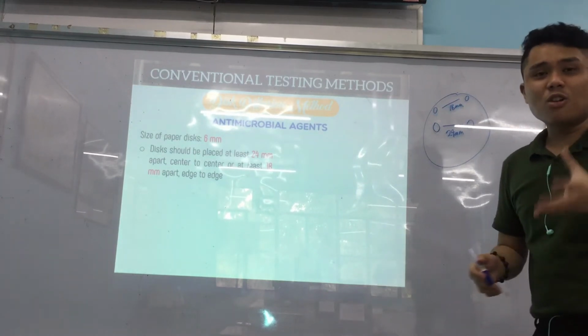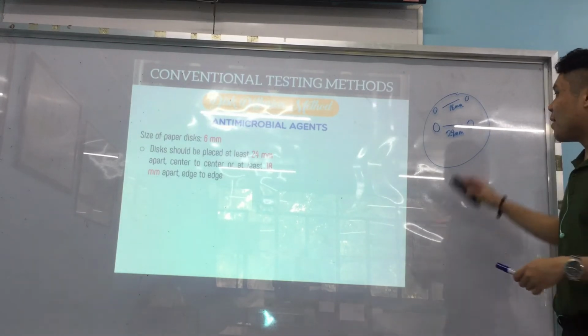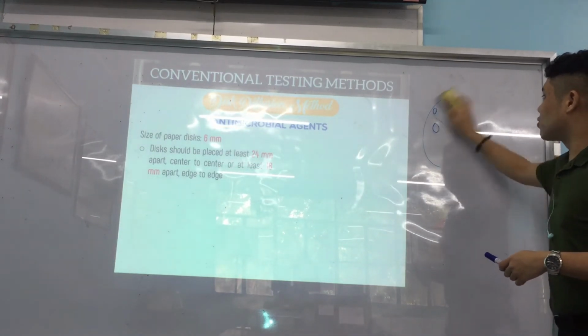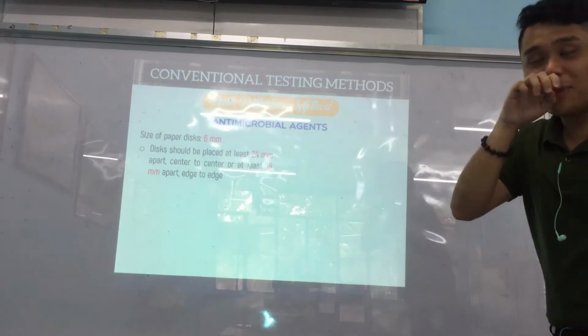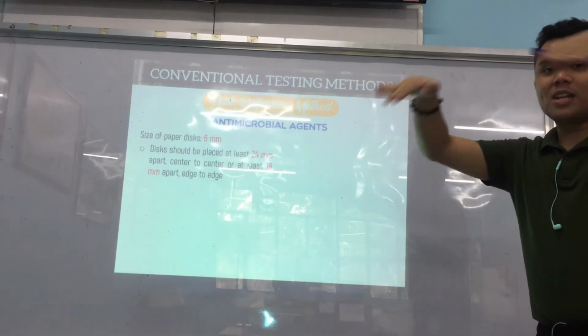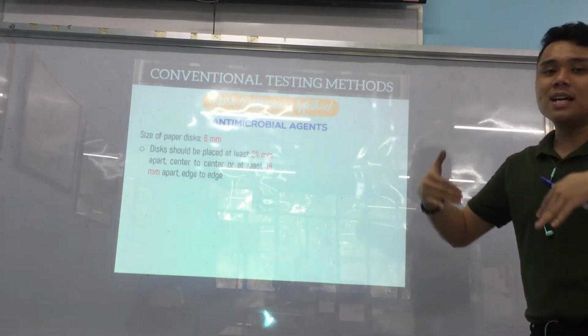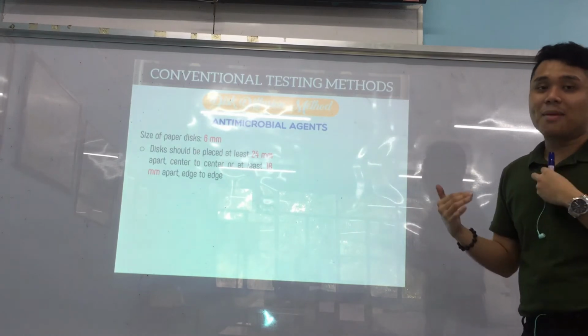Okay? Alright. Because nganong kailangan na i-distance? Para we make sure na ang zone of inhibition, dili sila mag-overlap, okay? And that perfect yun ang ma-form na zones. Again, para dili mag-overlap. Pero naay times na mag-overlap sila, especially if daghan na discs imuhang gigamit.